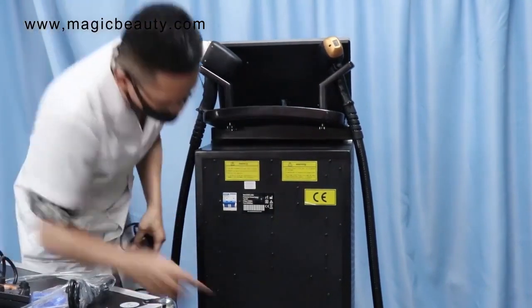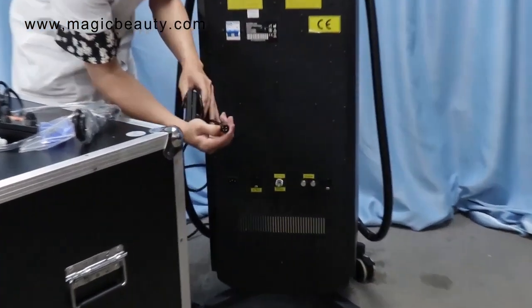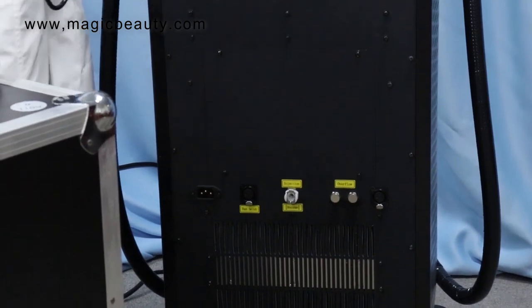If you want to connect the foot switch, there are two sides to connect it. The foot switch can do the operation, and both handles can control the system independently.